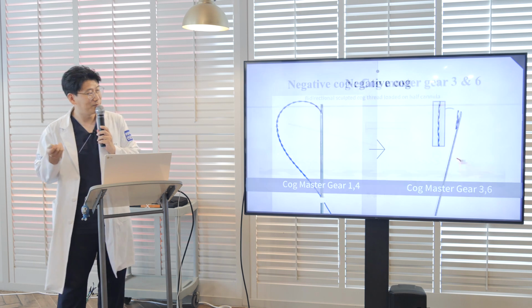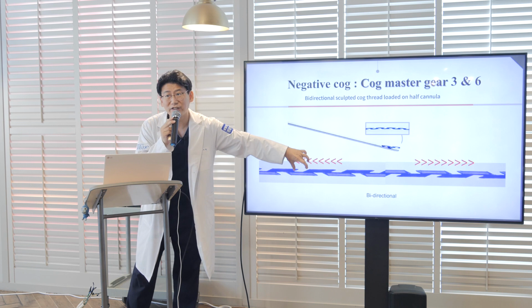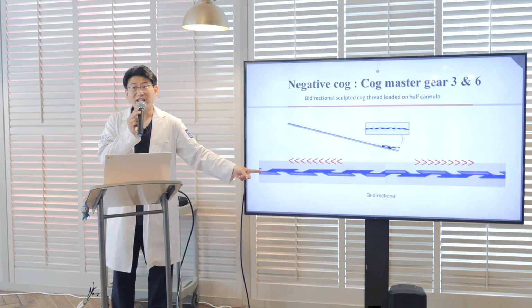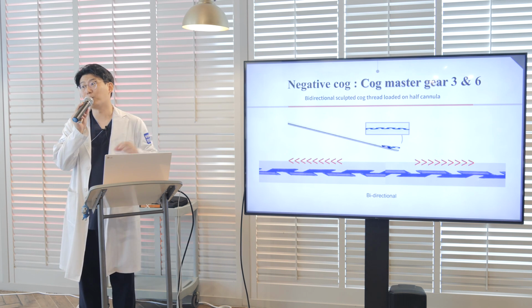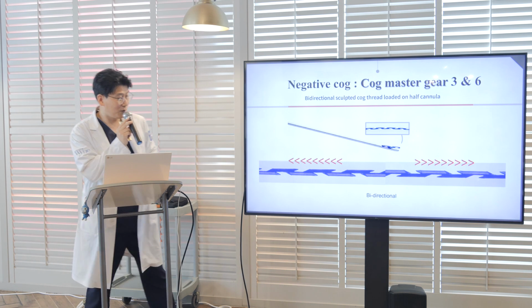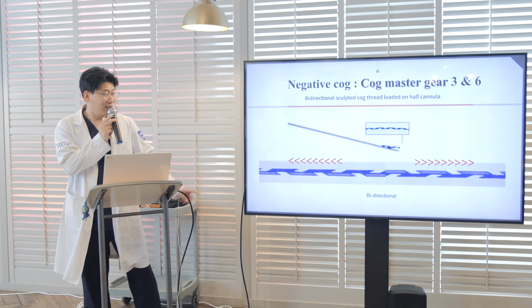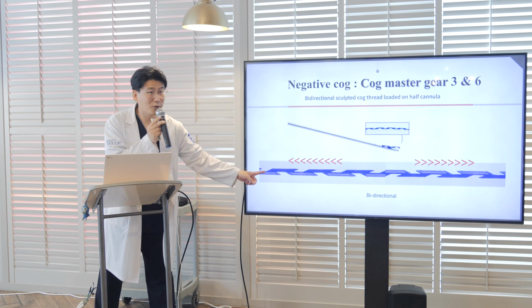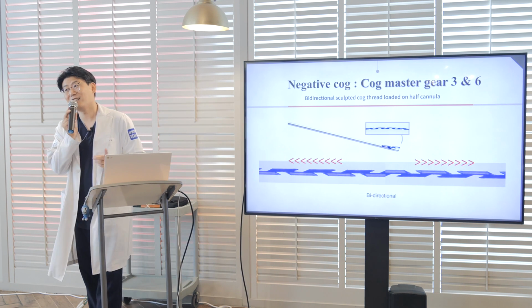It looks okay. They punched out this portion to create a cog. This thread is really thick as number 3, the thickest one, very thick. So even though it's weakened point here, but it cannot be easily cut. This big portion can be a cog. They can catch this big tissue. It's really potent.